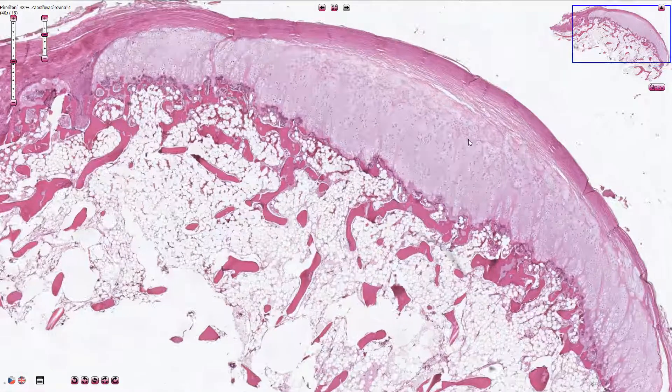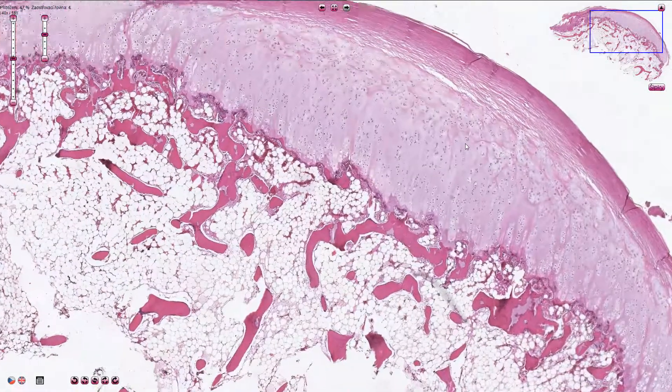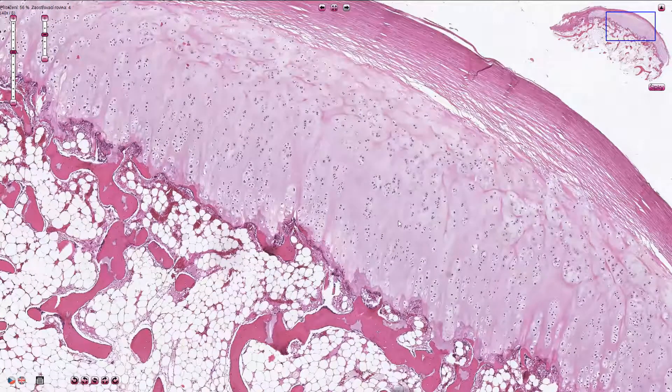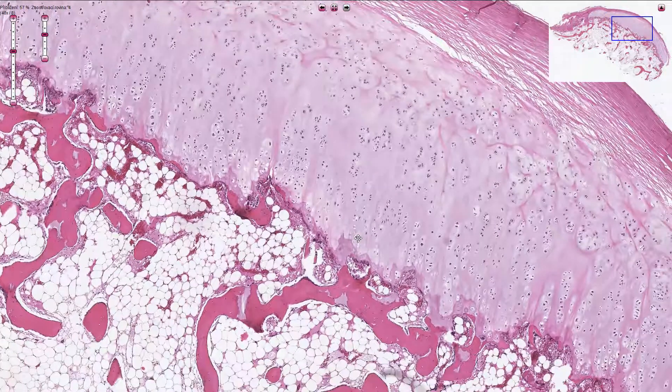The cartilage has normal small cellularity and is composed of bland lacunar cells. The cellularity is slightly higher in the deep levels of the cartilage. Chondrocytes are also slightly bigger as we go deeper.